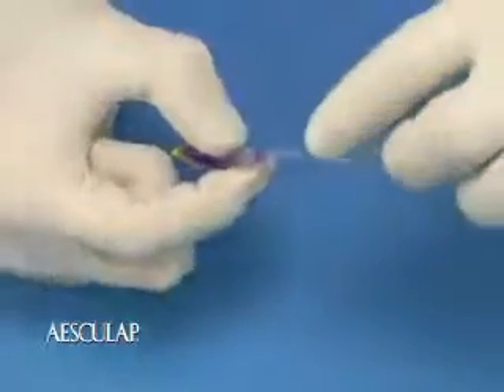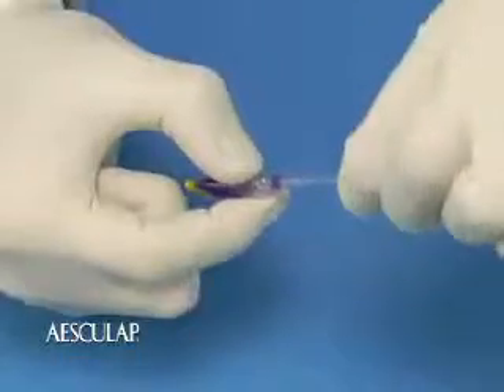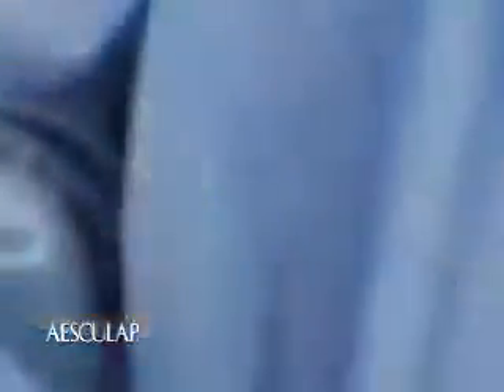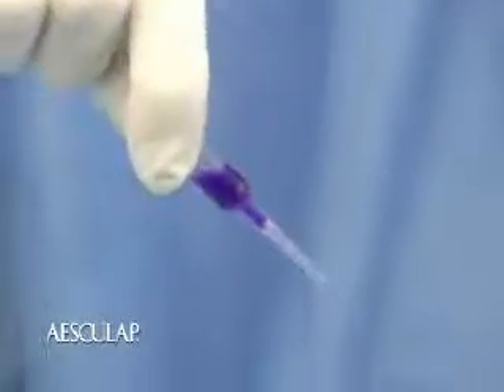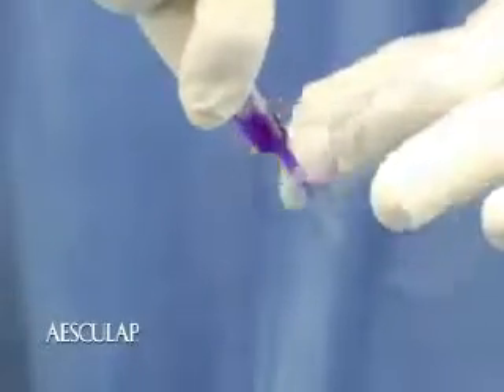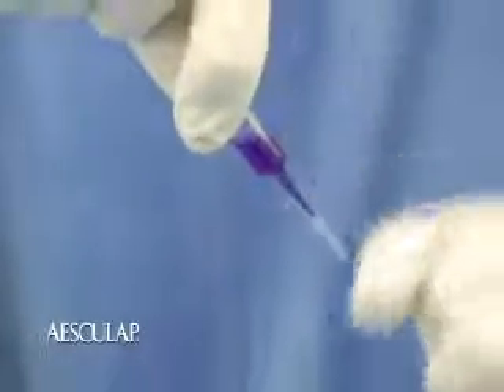To open the ampule, hold it securely as shown, then twist the tip a full revolution until it comes off. Without squeezing the ampule, turn it over so the applicator tip is pointed down. Then gently tap the ampule to load the tip with the adhesive.